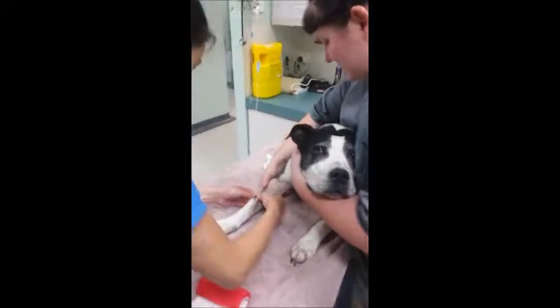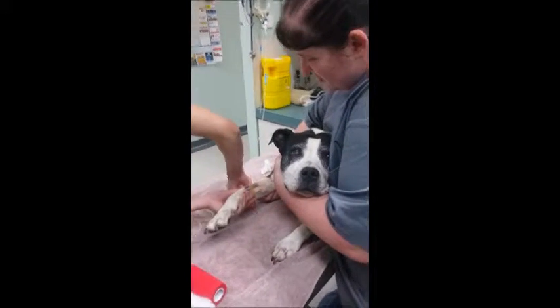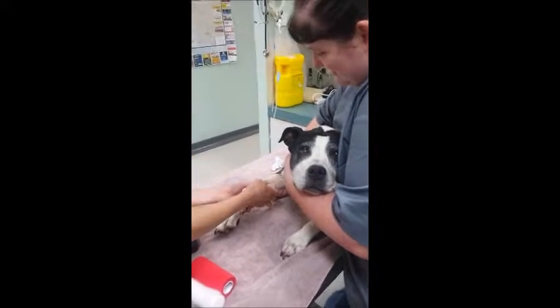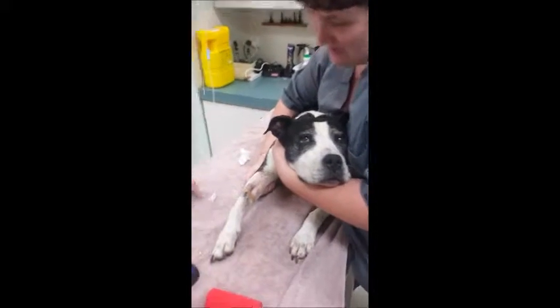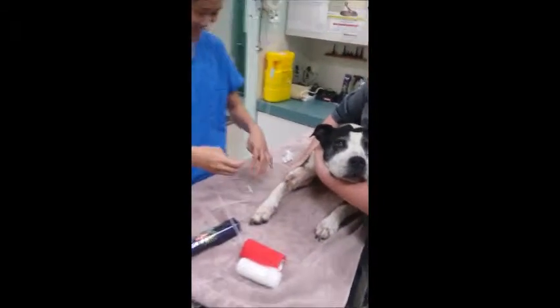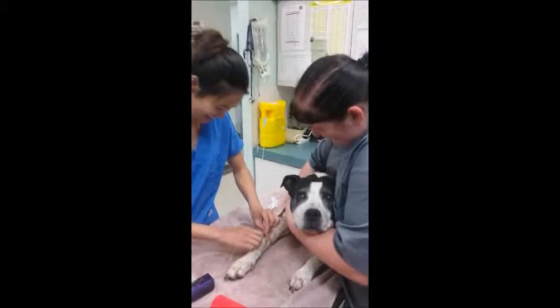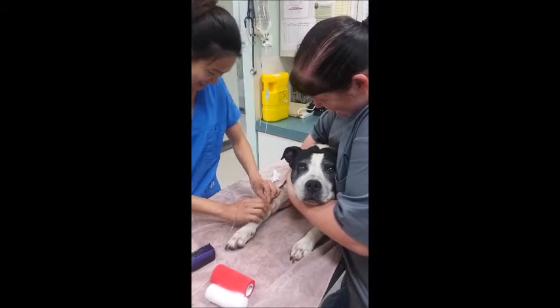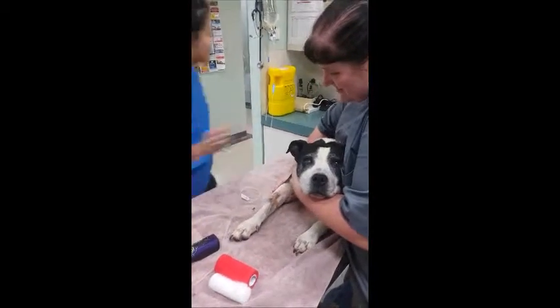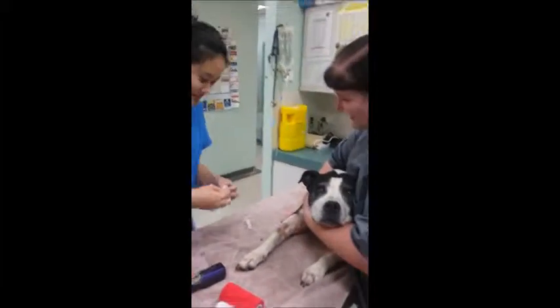Now that the catheter has been placed, it is secured using elastoplast that has been cut into strips prior to placing the catheter. The veterinarian is now placing the infusion tube into the intravenous catheter. The fluid control is then opened to flush the catheter. The infusion tube is then secured with a strip of elastoplast and the leg is bandaged.